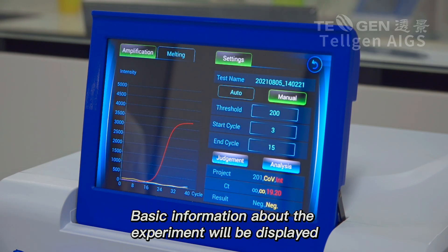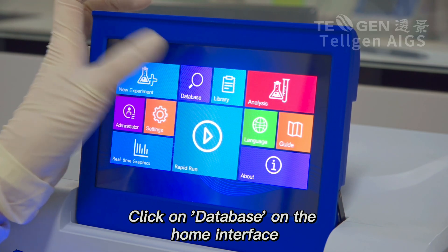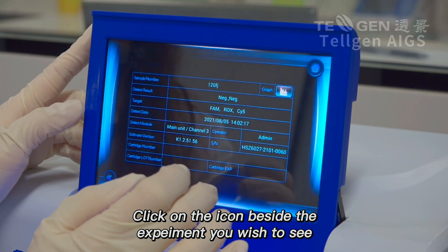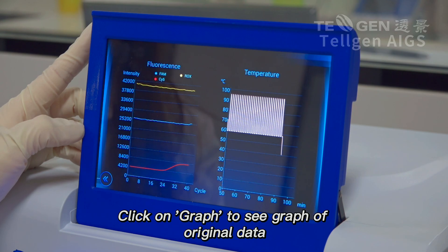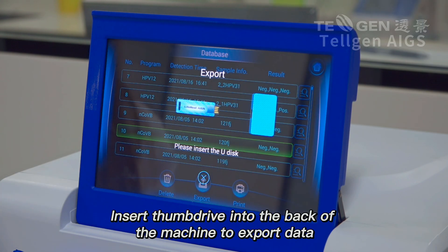Basic information about the experiment will be displayed. Original data and data export. Click on Database on the home interface. Click on the icon beside the experiment you wish to see. Click on Graph to see the graph of original data. To export data, select the data you wish to export and click Export. Insert a thumb drive into the back of the machine to export data.